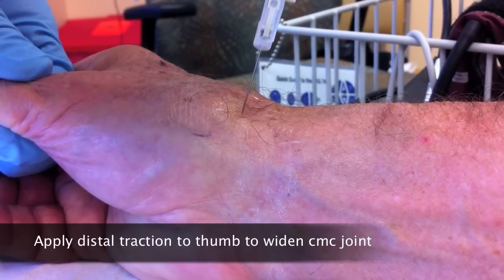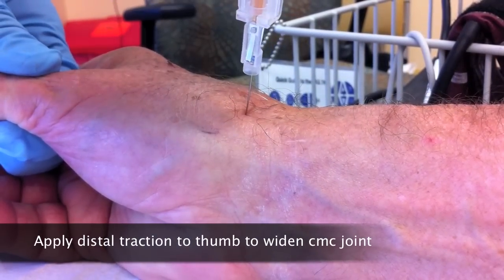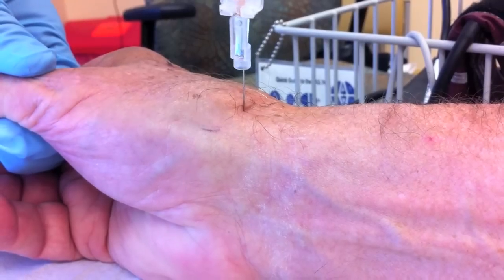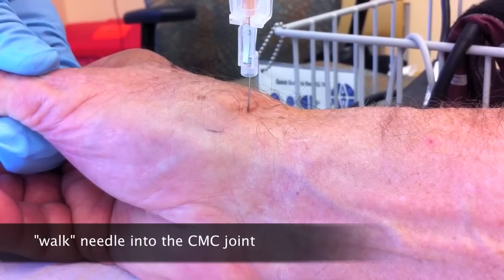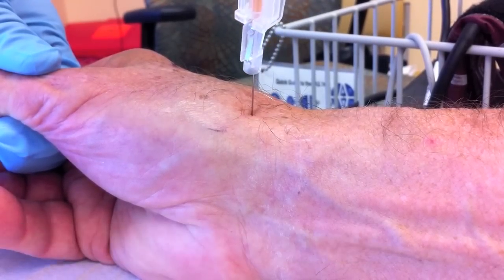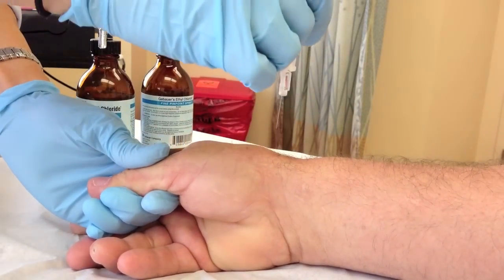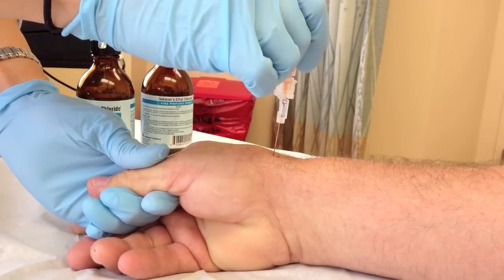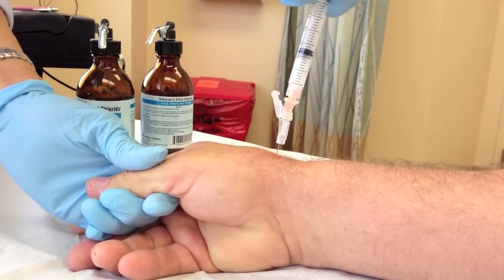Topical ethyl chloride can help decrease the pain of needle entry. An arthritic CMC joint can be very narrow, so distal traction on the thumb can help open up the joint. If the needle does not go directly into the CMC joint, then walk the needle until it sinks into the joint space. Getting your needle into the narrow CMC joint space is the trickiest part of this injection, so we'll look at two more examples.